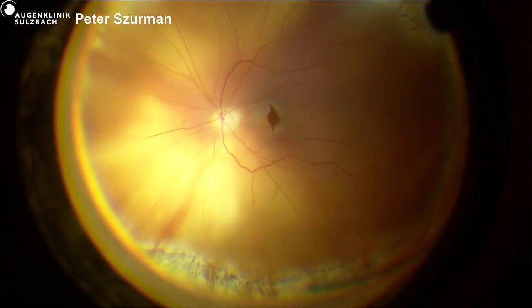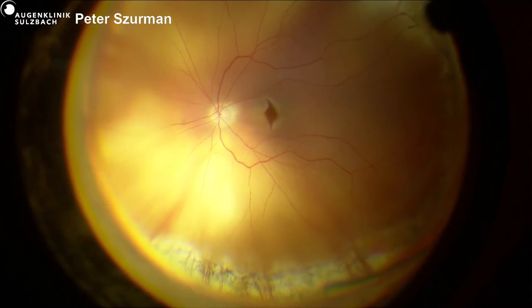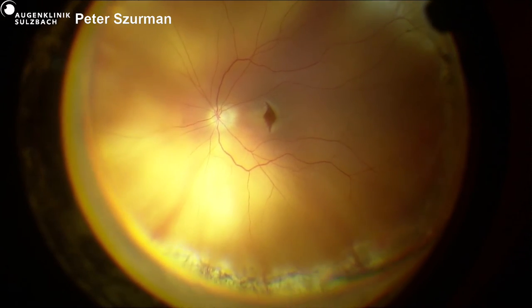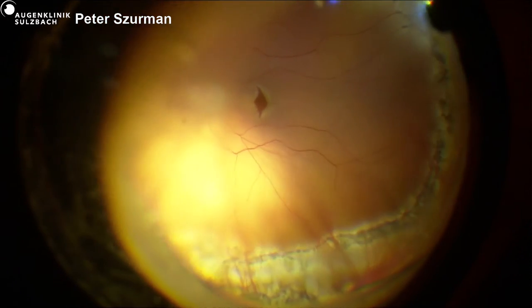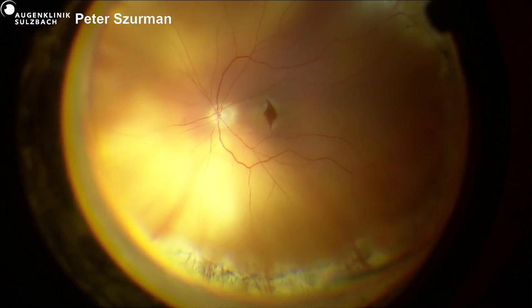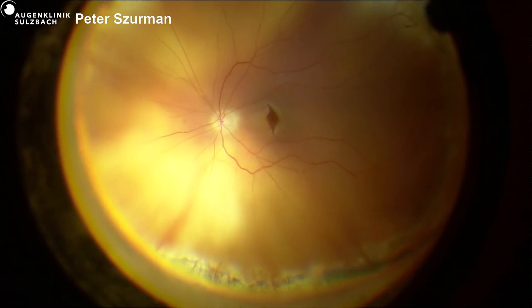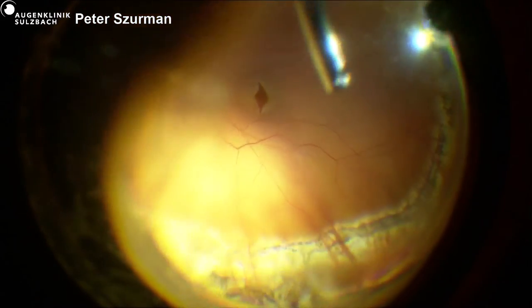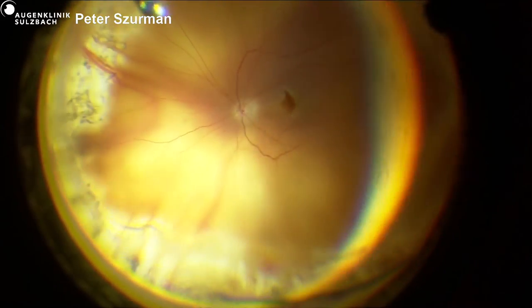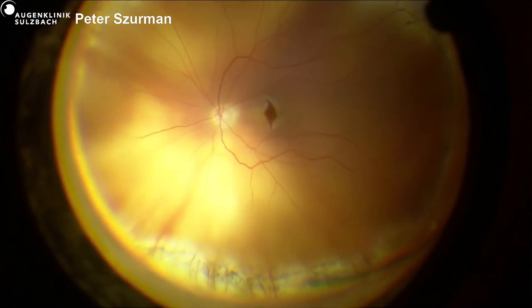So this is the situation, and the strategy will be first to stain and look for PVR membranes, and then to close the break again with an epimacular amniotic patch. So you see this helps in several situations, not only for standard macular holes.